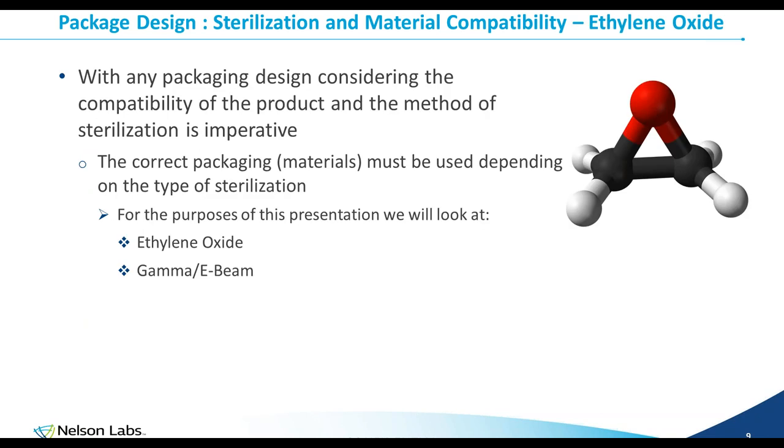With any packaging consideration, as far as medical device goes, you have to consider sterilization. Now, there's different ways of sterilization. The ones that we're going to look at are radiation and ethylene oxide, and what potential effects they could have on the product, the packaging, or the person using them.